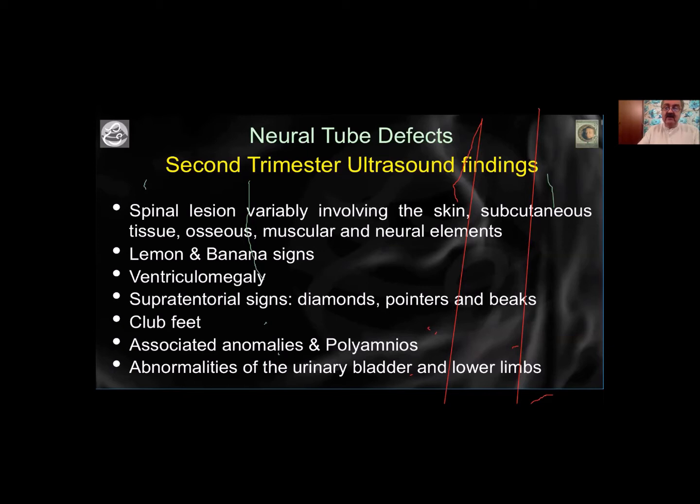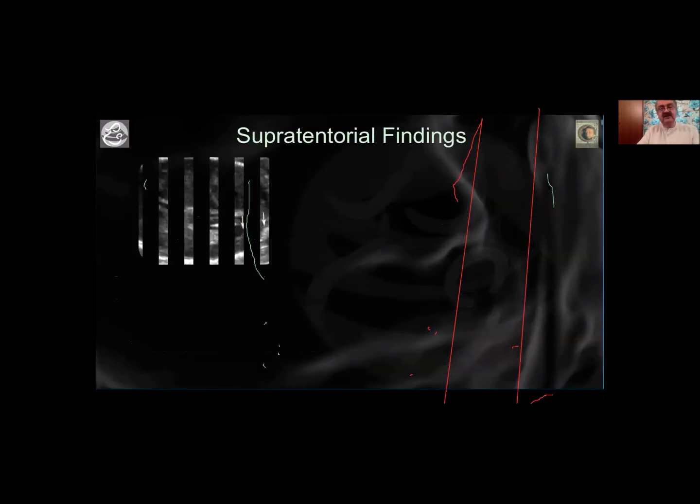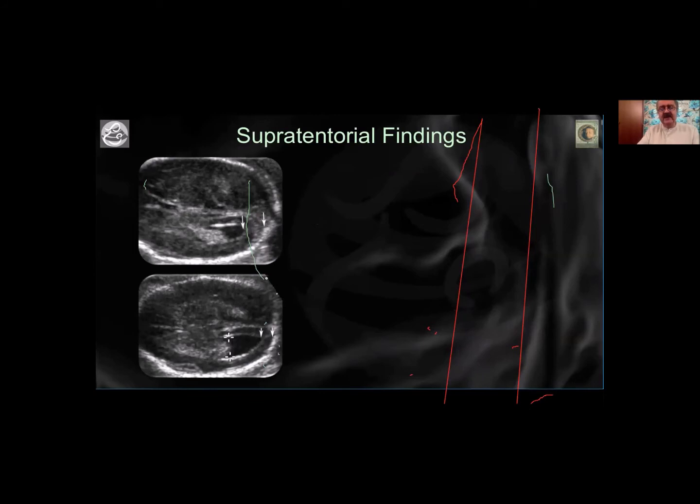That will help the neurologist to prognosticate far better than usual, and the patient will then understand whether they will accept this situation or they don't want to accept this situation, and then you will find everything. For instance, a lot of people seem to forget that there are subtle signs. So if I don't find a very dilated lateral ventricle like this, it's not really more than 10 millimeters, I should find a large amount of space between the end of the lateral ventricle on the occipital side and the extent of cerebral parenchyma there.